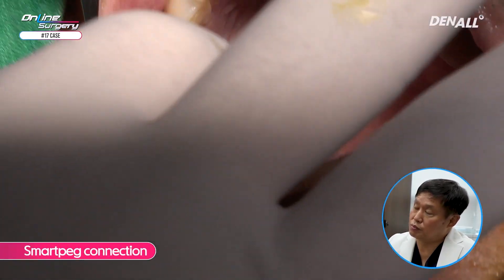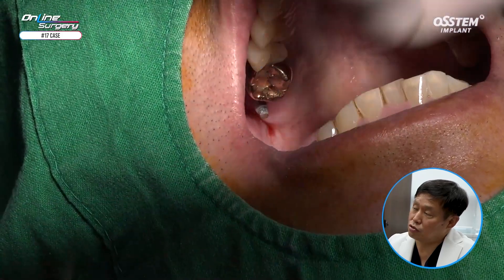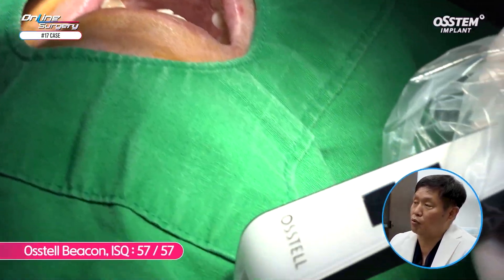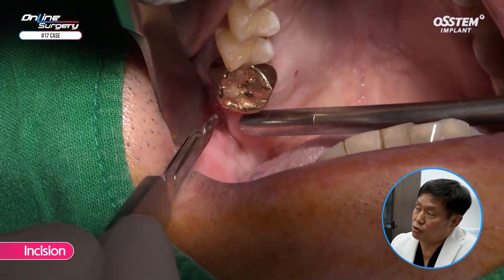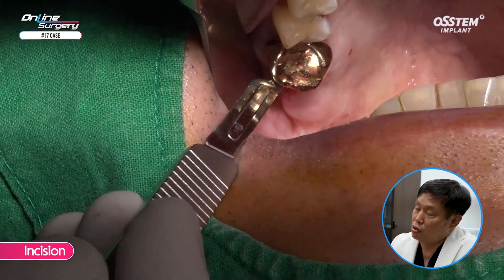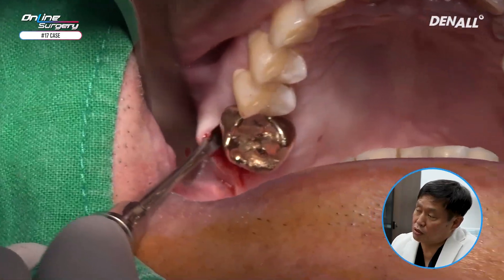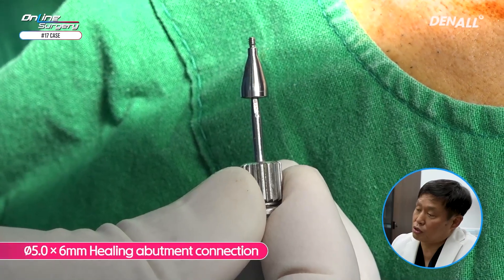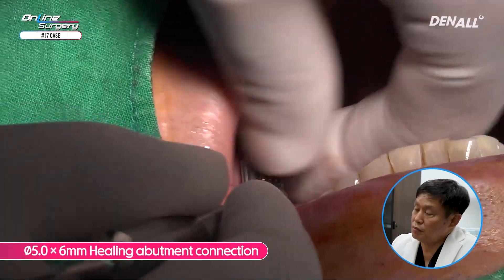The template was removed and the SmartPeg was connected. Because the bone quality was not excellent, the ISQ measurements were not that good — about 57/57. In order to do additional bone graft on the buccal side after implant placement, an incision was made. Flap elevation was done on the buccal side. Before doing the bone graft, to make sure material does not go inside the implant, the healing abutment was connected first — a 5.0 by 6 mm healing abutment.